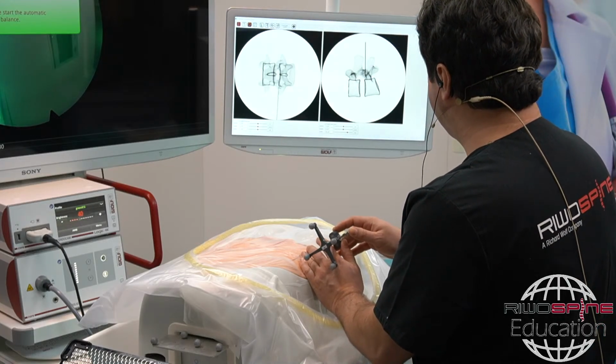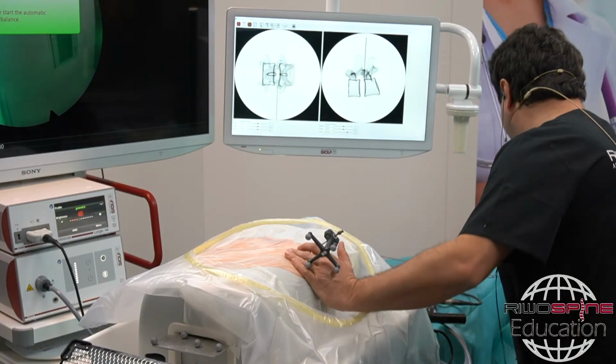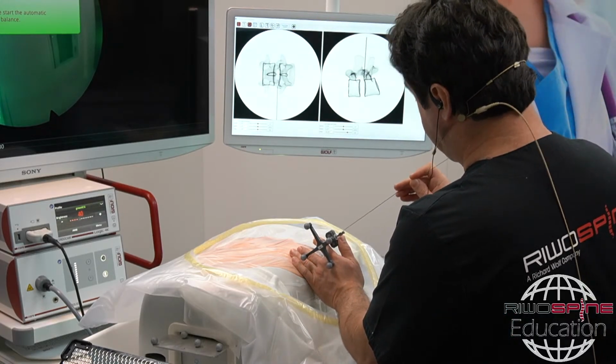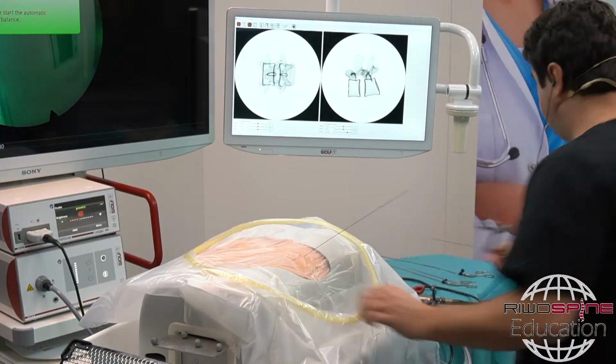Is this the question, Robert? Yes, okay. Thank you. Then the next step, I keep the guide wire inside and remove the needle.